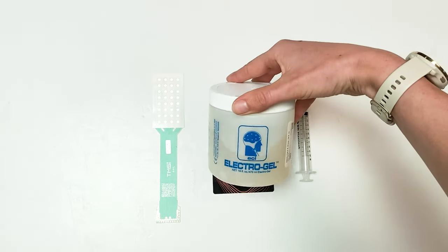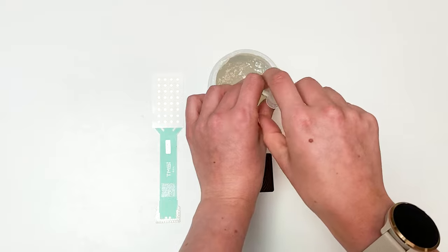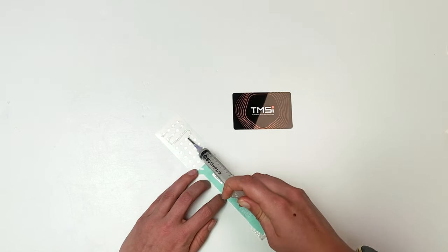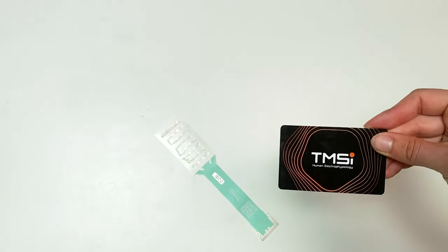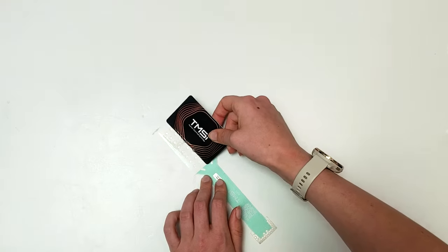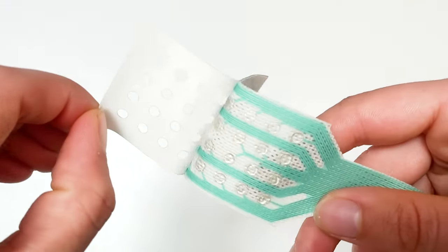First, take your blunt needle syringe and draw up approximately 0.5 ml of electrode gel. Next, place the gel on the grid and use an applicator card to spread the gel evenly over all electrodes. Finally, remove the sticker and set the grid aside.